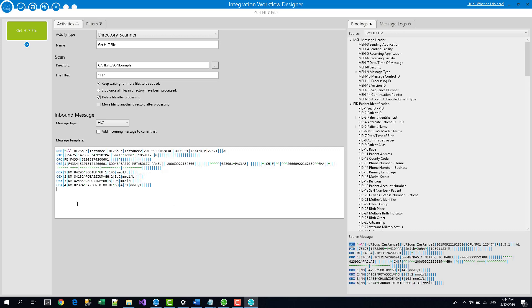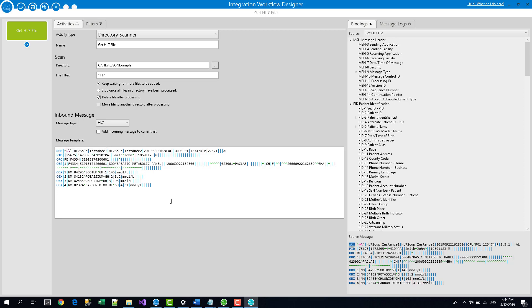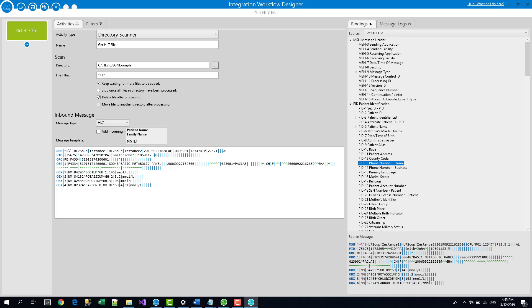The reason I have it is it's got PID information and a little bit of OBX data. I'm going to use that to show the simple way and perhaps a slightly more complicated conversion as well. So you can see now I've pasted it in, we've got a tree over on this right hand panel. This represents the HL7 message we can see in the message template. You'll notice if I click on an item inside the tree, it highlights the exact same place in the message template.